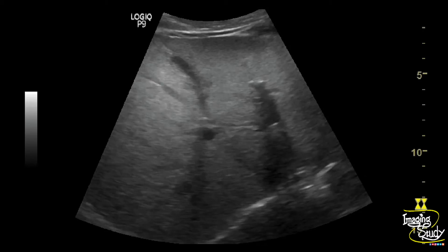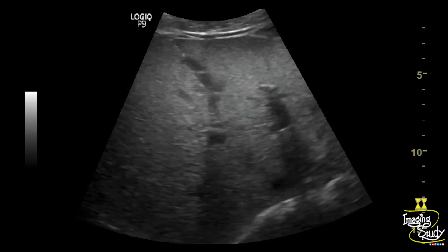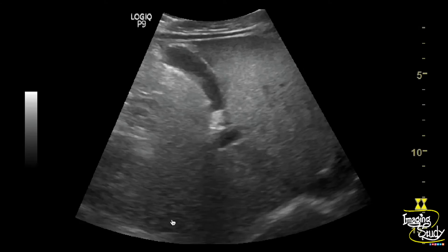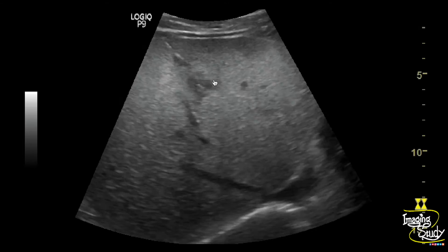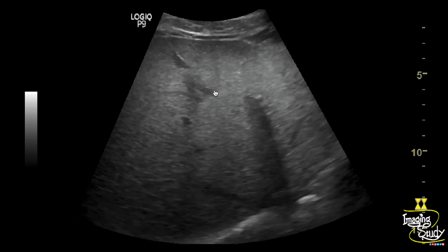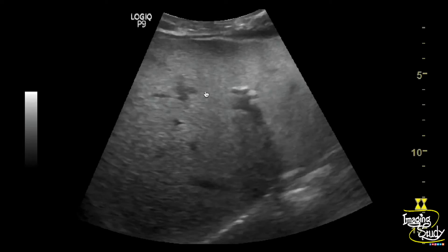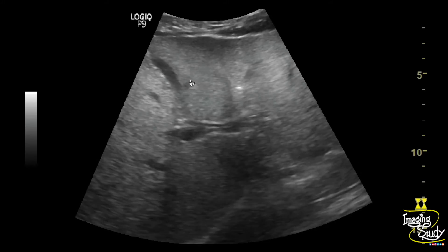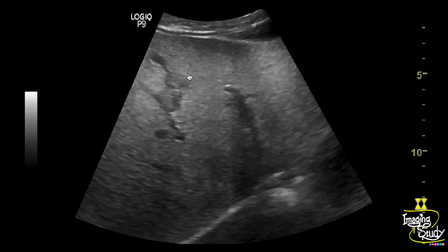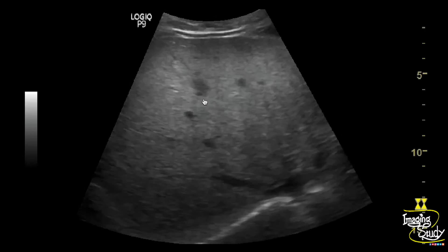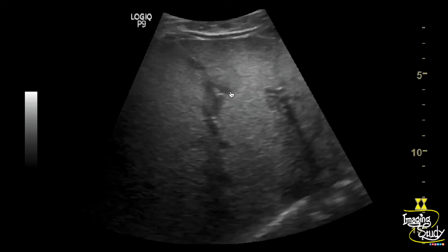Here you can see the hyperechoic liver due to mild steatosis. You can see a hypoechoic area adjacent to the gallbladder at the medial segment of the left lobe — that is segment 4.